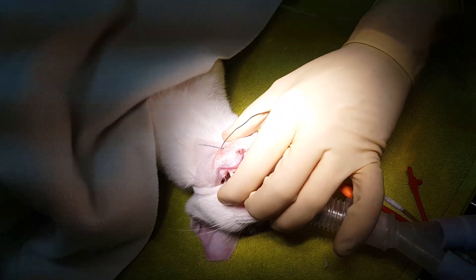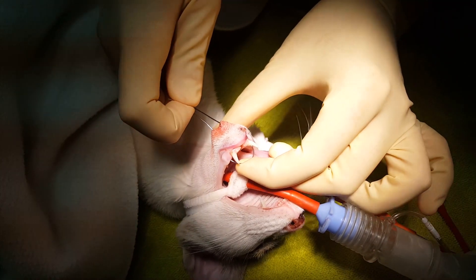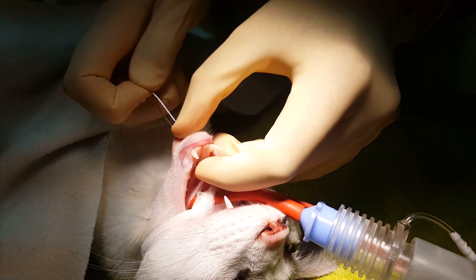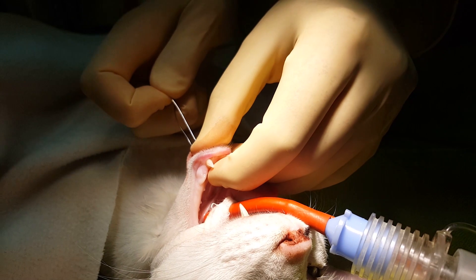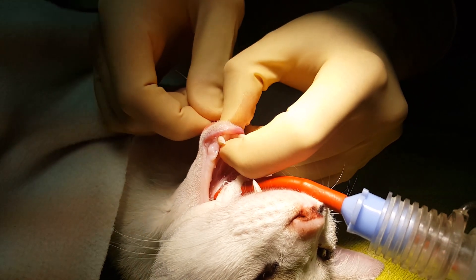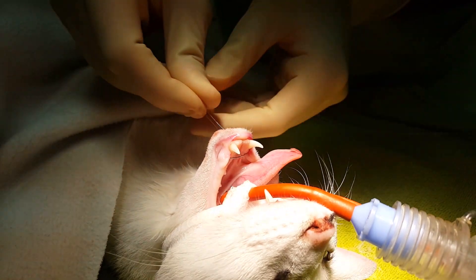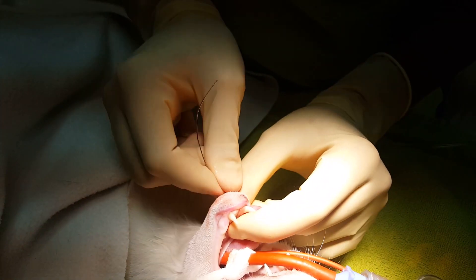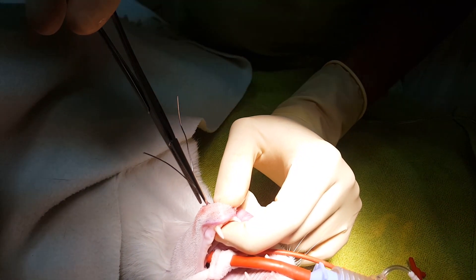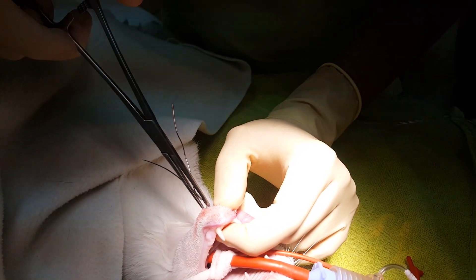Now we have the needle that's gone completely through. We need to place the wire across the jaw and stabilize the jaw this way, gently using the wire as a brace to keep the jaw together like this, so it's nice and symmetrical, and we start applying some pressure using force to stabilize the jaw.